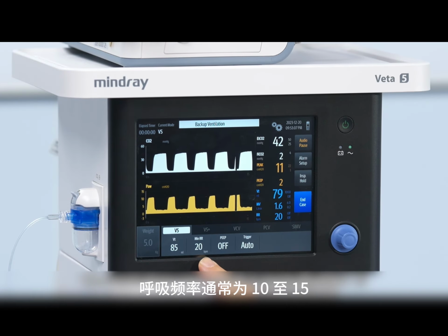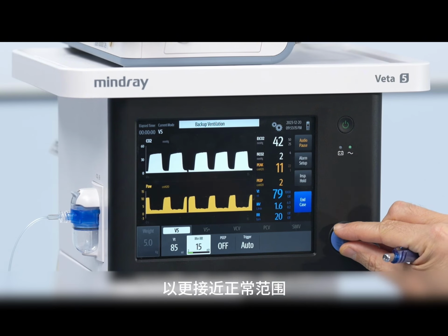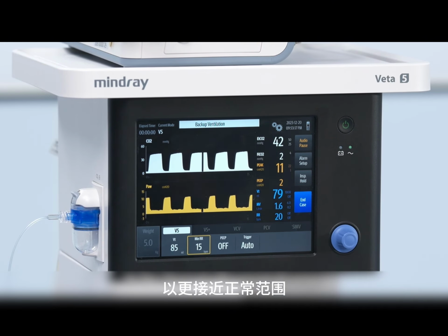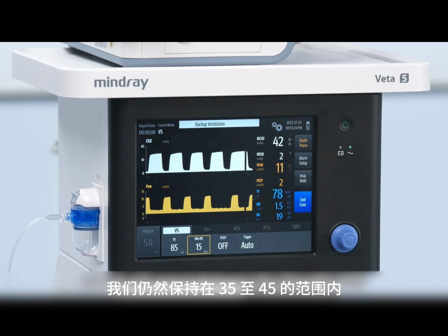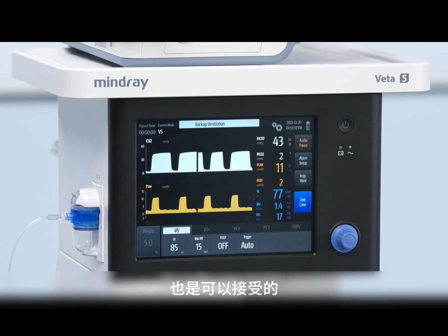The respiratory rate, which is normally 10 to 15, is currently set to 20. So I will reduce it to about 15 to be closer to the normal range. And let's see what happens with this animal. Hopefully, we will still remain between the 35 to 45 range. Or even if we are a little bit outside of that range, it can be acceptable.